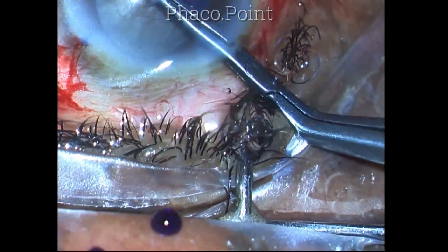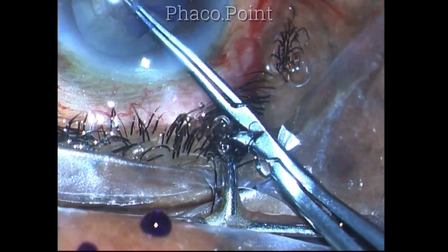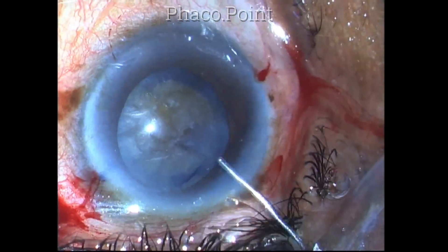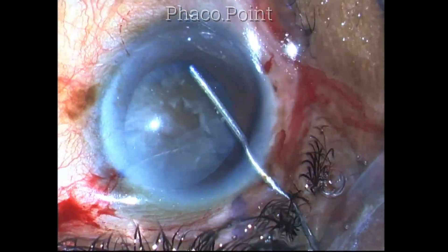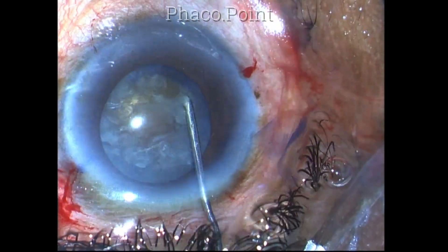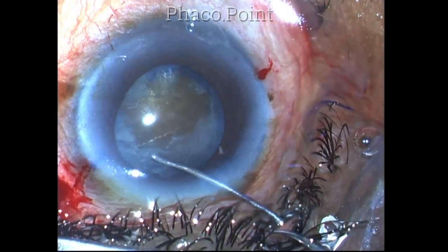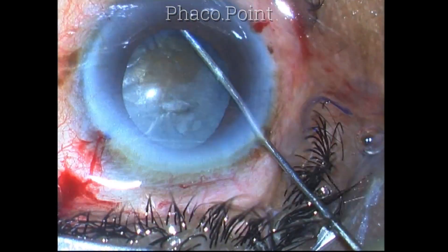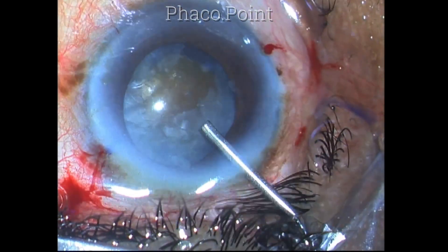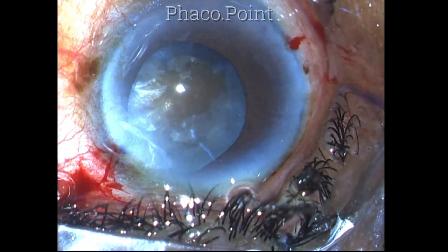A slightly larger capsulorhexis is important to be able to mobilize the nucleus fragments, which I think will be a little large in this case. Gentle cortical cleavage hydrodissection is done. We need to inject very small amounts of fluid and it's very easy to break the corticocapsular adhesions in such cases.